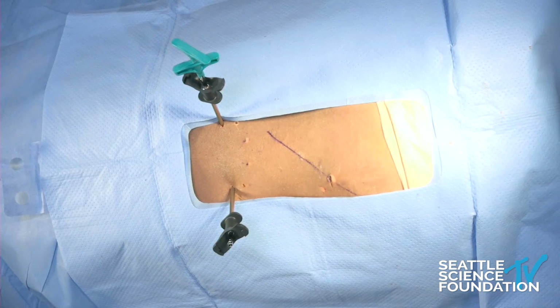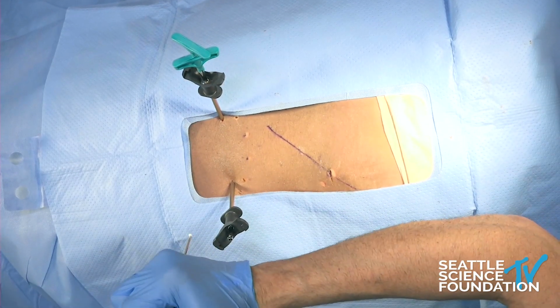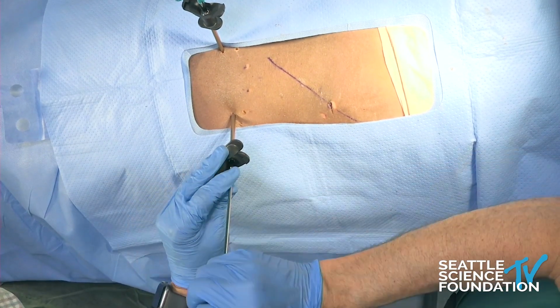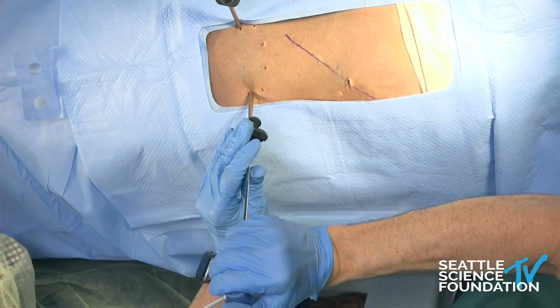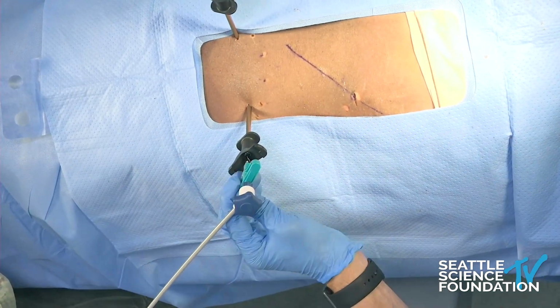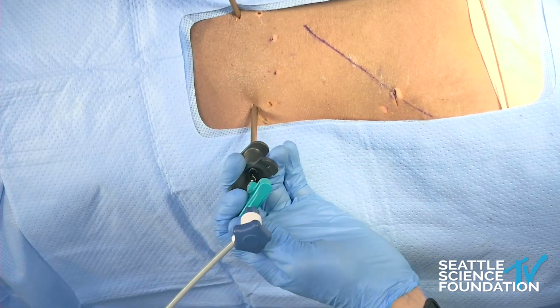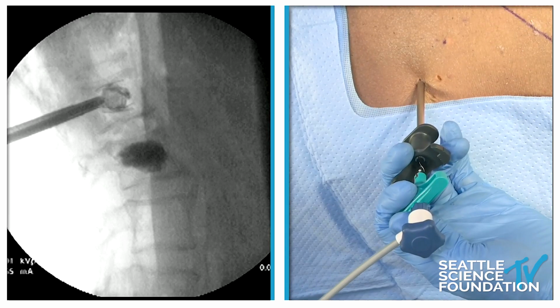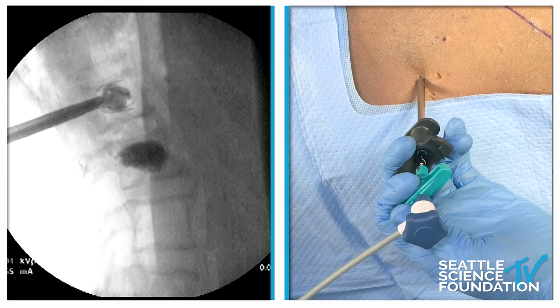And this is an automated mixer, and this comes out, go ahead and hold that, at about 800 Pascal seconds. This is very, very thick, viscous cement, and it's nice. And this has a collar, it locks on here. So we'll go ahead and just give it a couple turns, and we'll be able to see this as cement goes in. Very nice.